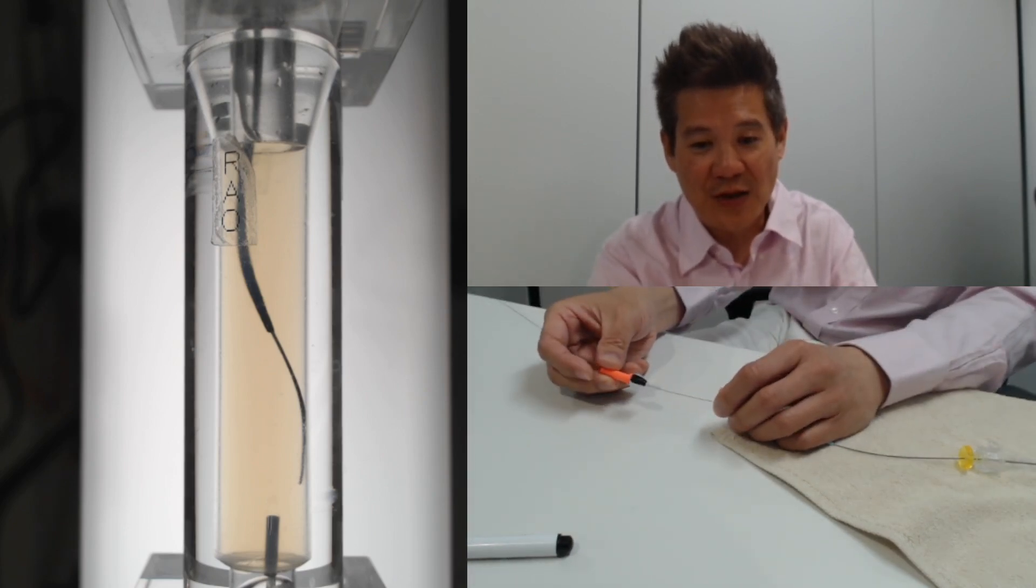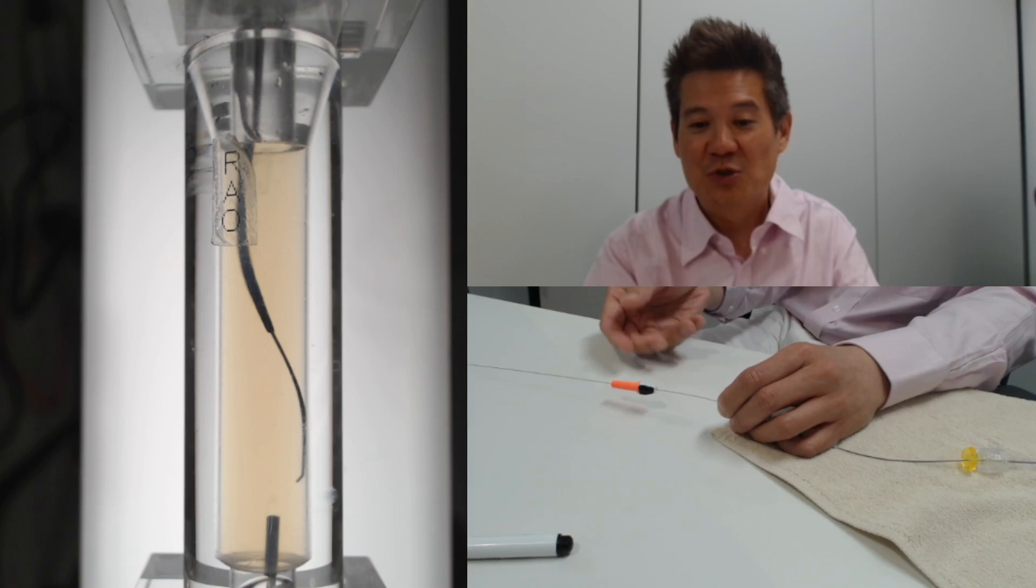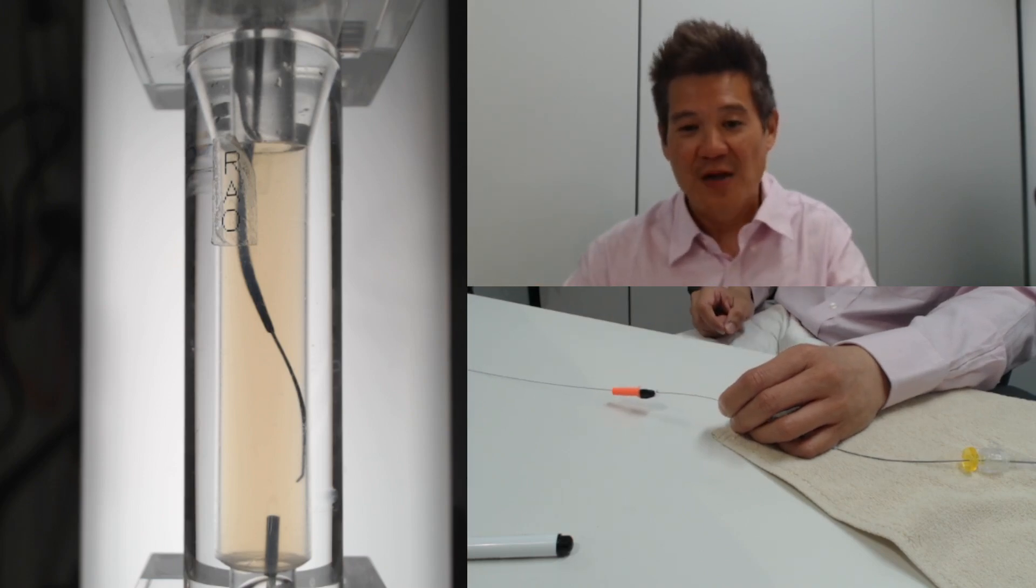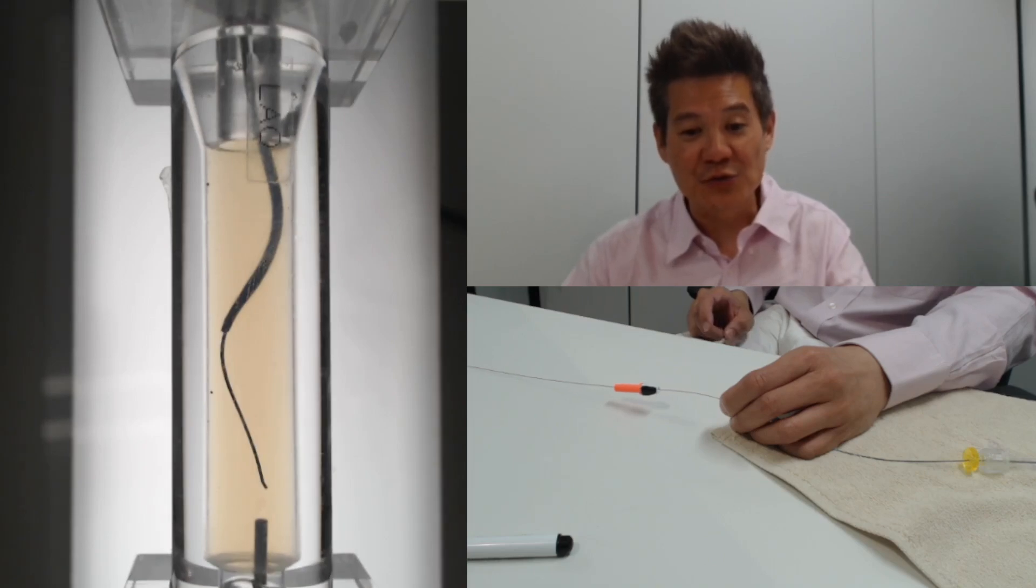Now in this view we want to turn the wire tip so that it faces most towards the distal target. This is very simple because we do this all the time in our CTO intervention. We turn the wire tip towards the target, then we go to the other view.